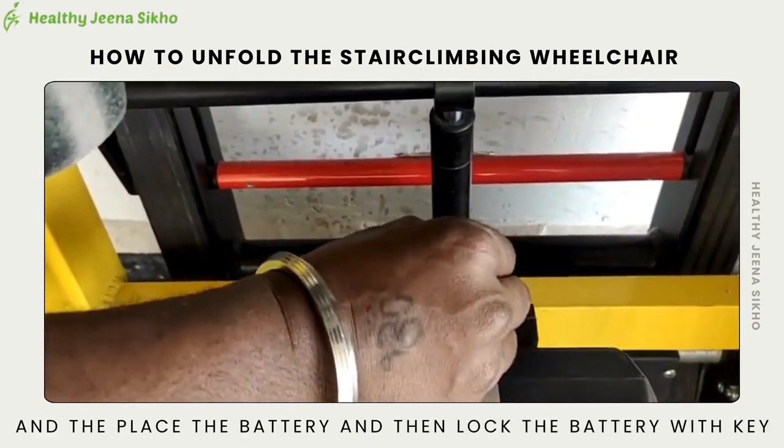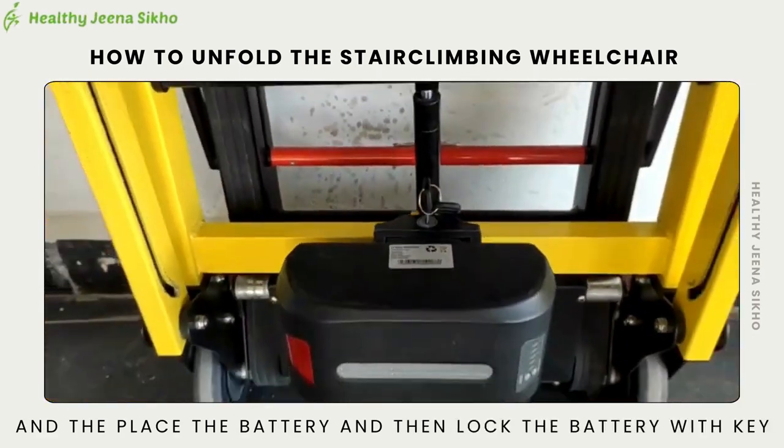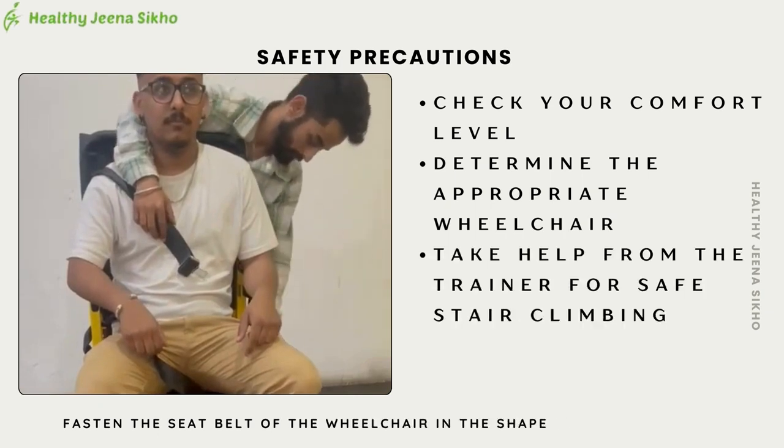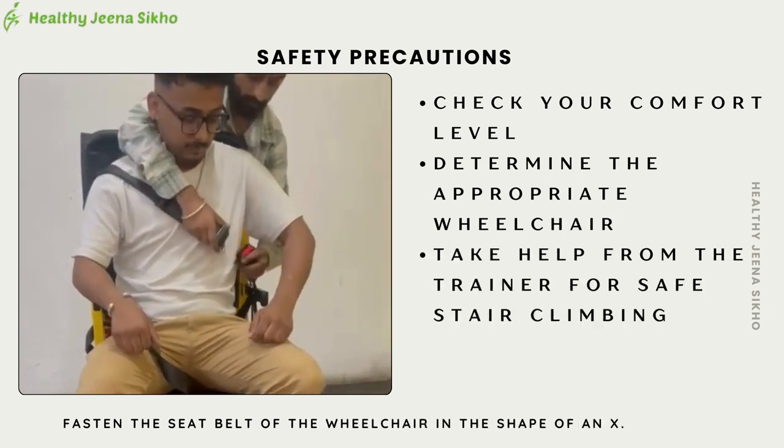Place the battery and then lock the battery with the key. Fasten the seat belt of the wheelchair in the shape of an X.